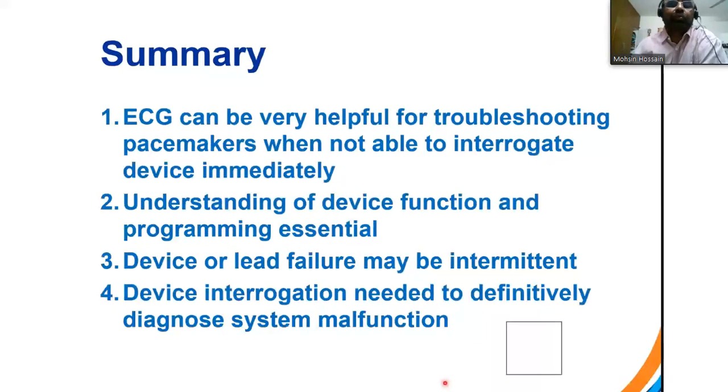In summary, we can conclude ECG can be very helpful for troubleshooting a pacemaker when we are not able to interrogate the device immediately. Understanding of the device function and programming is essential. Device or lead failure may be intermittent. Device interrogation is needed to diagnose system malfunction.